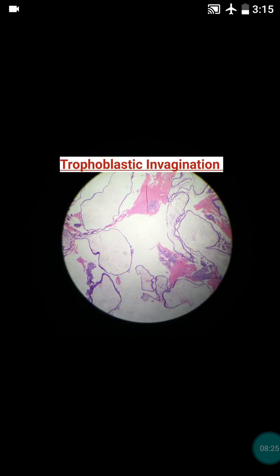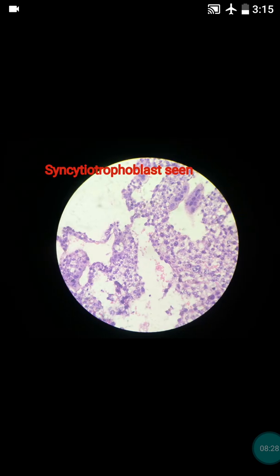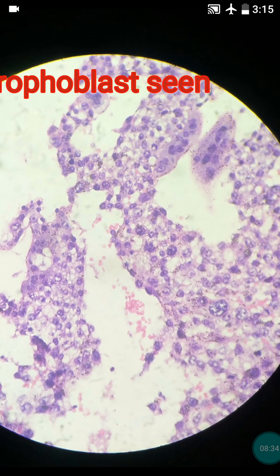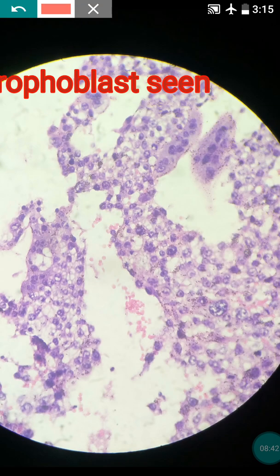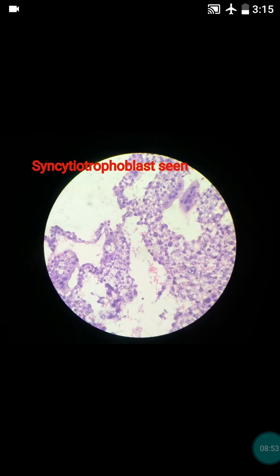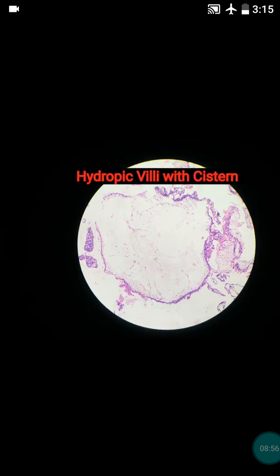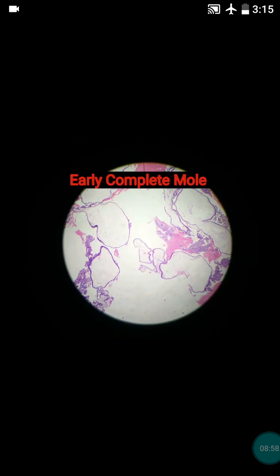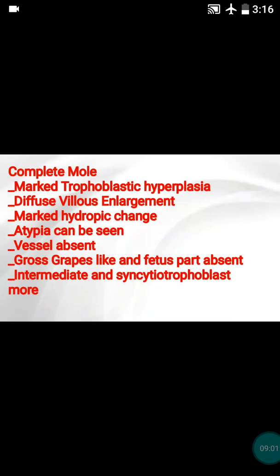This complete hydatidiform mole is usually formed due to abnormal gametogenesis and fertilization. One important point regarding cytotrophoblast morphology: the cytoplasm is clear or eosinophilic with a single centrally placed vesicular nucleus, and they are small round mononuclear cells with distinct cell borders.